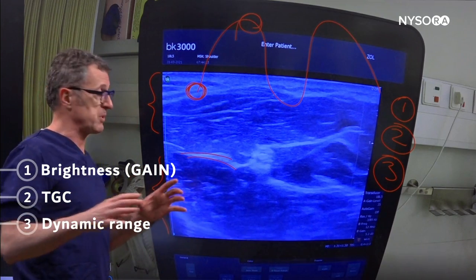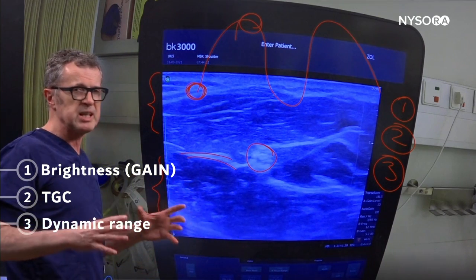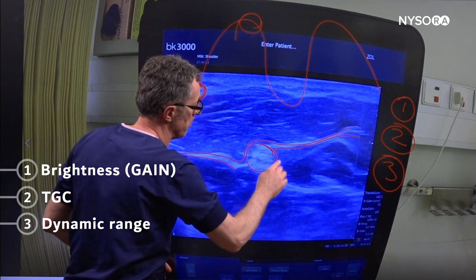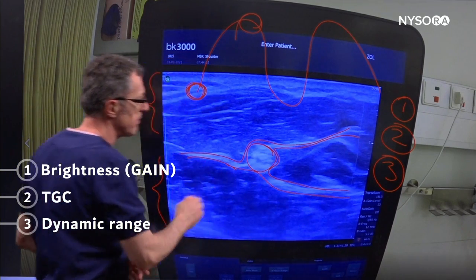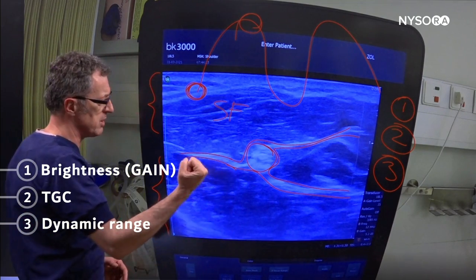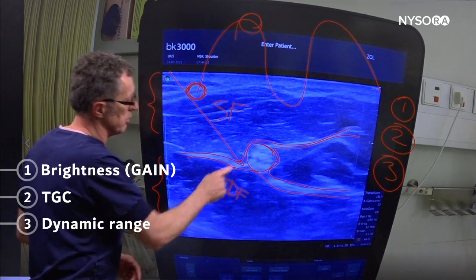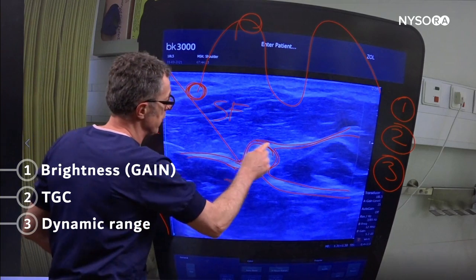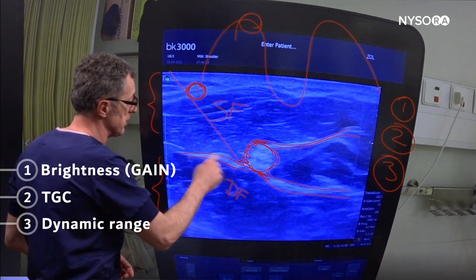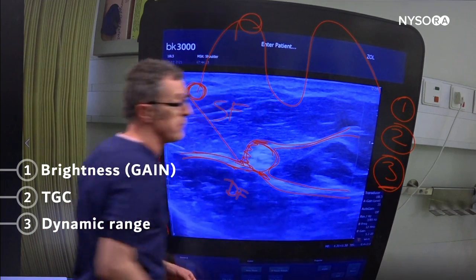In the median nerve block procedure, it's not necessary to see the median nerve very clearly, but it is very necessary to see the fascia that envelops it — specifically the fascia between the superficial flexors and the deep flexors of the wrist. This is where the injection of local anesthetic takes place to fill that space and accomplish the block. To accentuate that fascia, adjusting the dynamic range will be very useful.